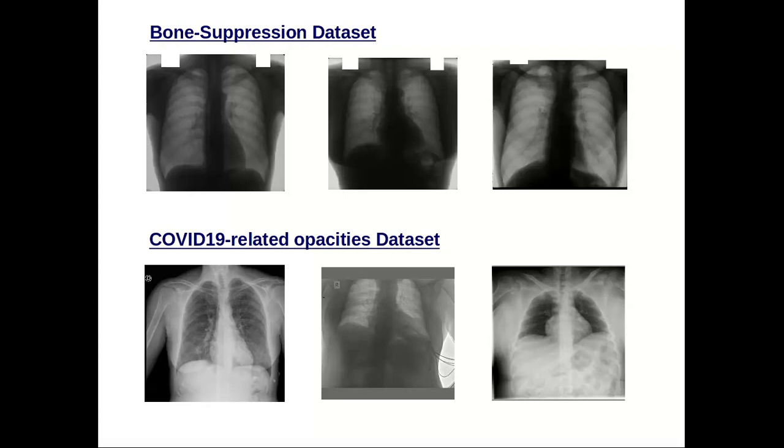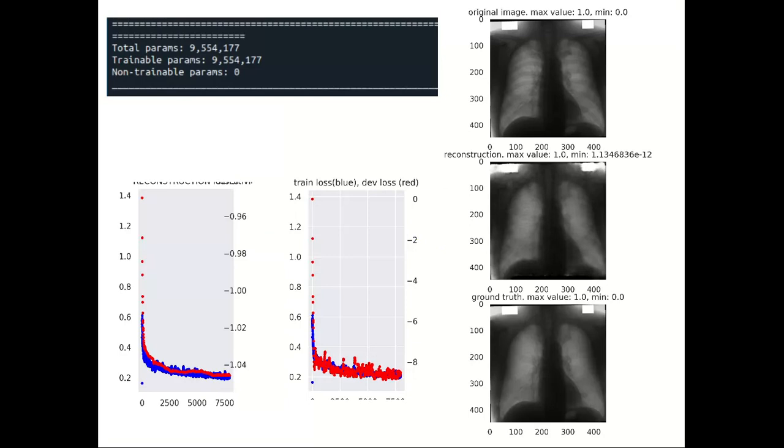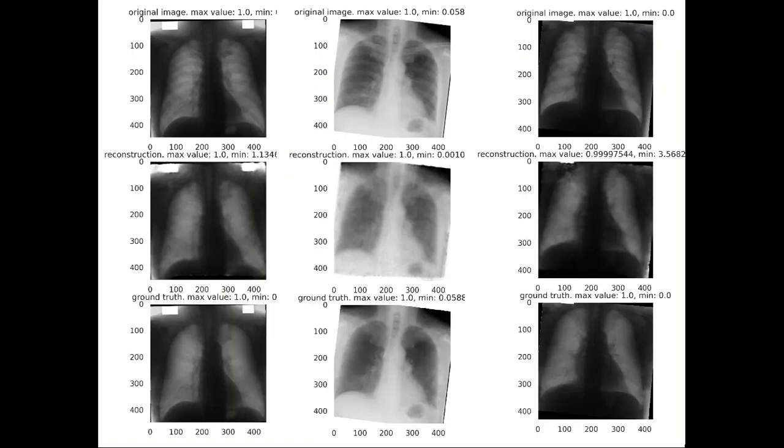We do that by augmentation that includes small 0 to 20% random zoom-outs, minus 10 to plus 10 degrees random rotations, small random shifts, and small random mild blurring. The bone removal model that I built here has 9.5 million trainable parameters, and it was trained in the standard way, letting it follow the gradient on the loss manifold for 12,500 training steps on a single GPU machine. I used small mini batches of 4 images and used the well-known Adam optimizer algorithm for navigating the neural network on the loss manifold toward a good self-organization of the model parameters.